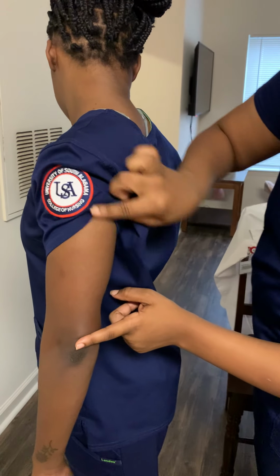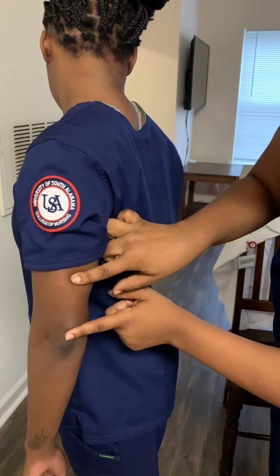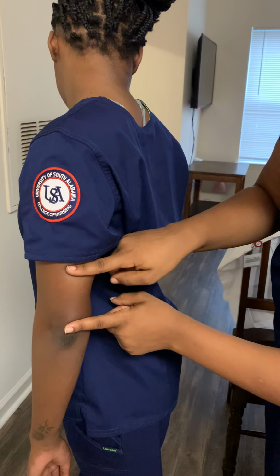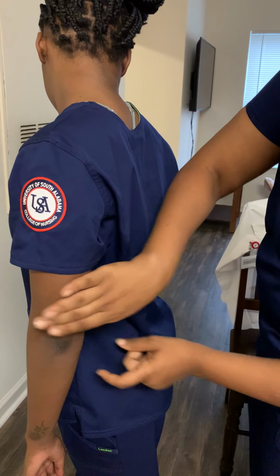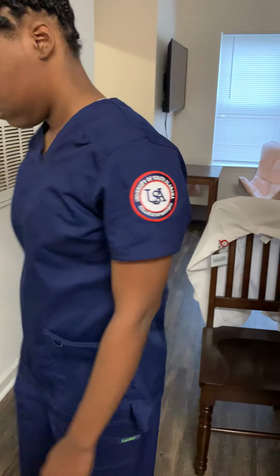I have the elbow here and located the bottom of the deltoid where it inserts into the bone, and this is where I'll be giving the medication.